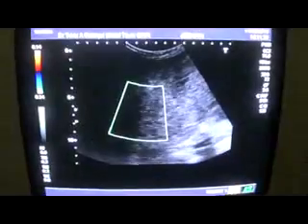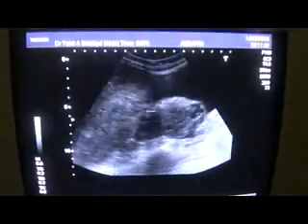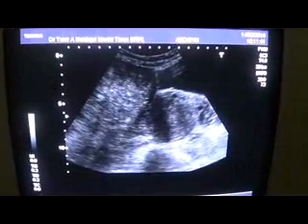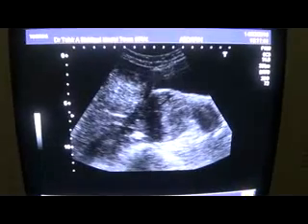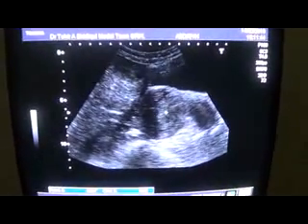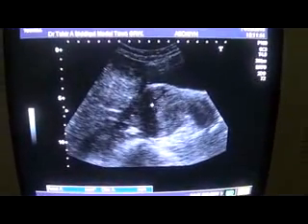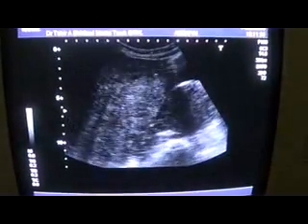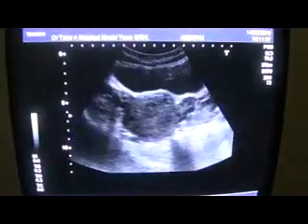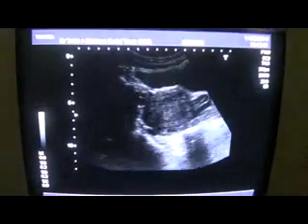I have shown you the longitudinal section, and the reason why she does not complain of any menstrual disorder is that the endometrial canal is spared by this mass that we are going to study later on. Now, first of all, let us rule out the ovaries.